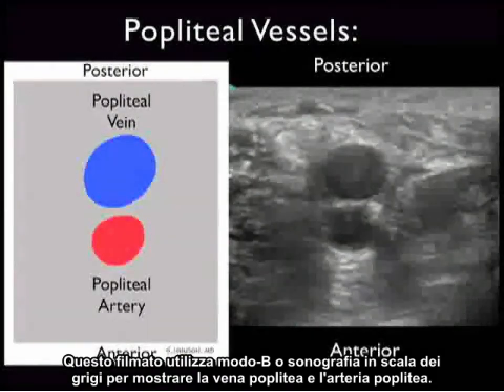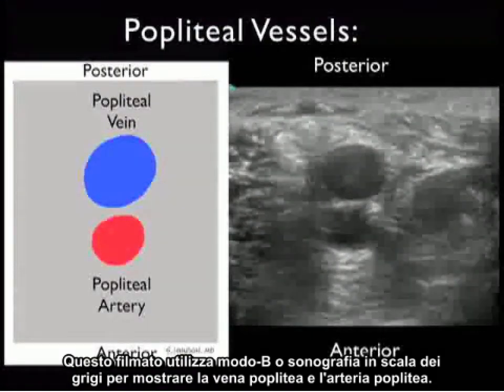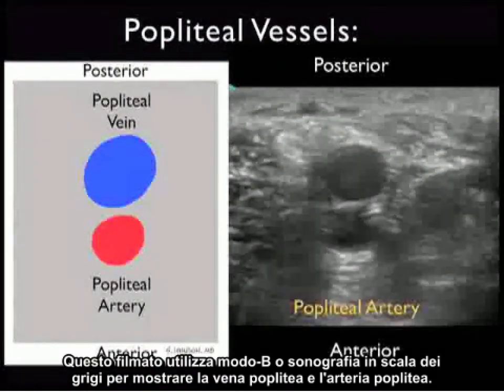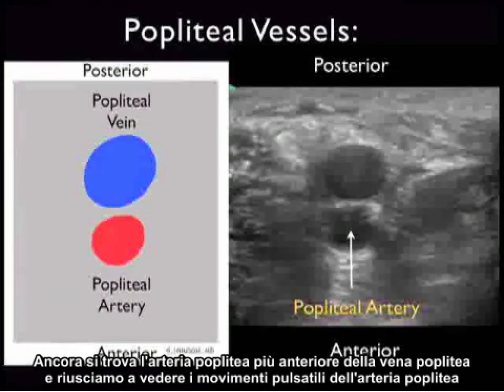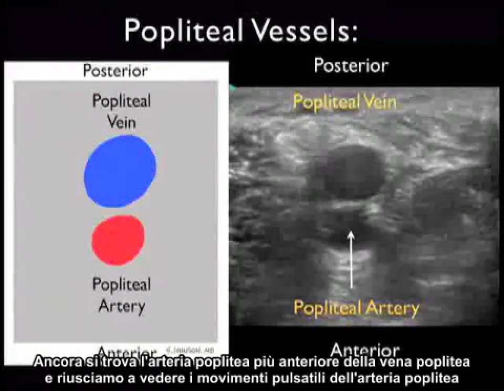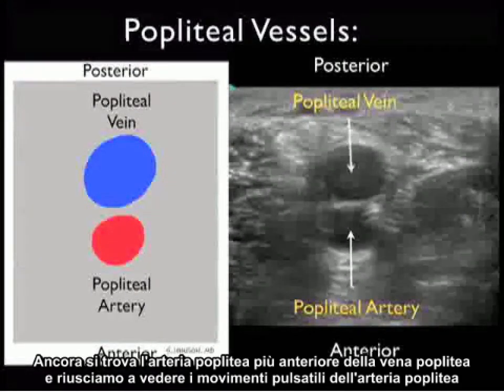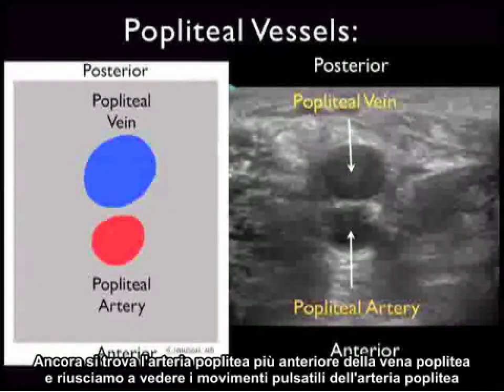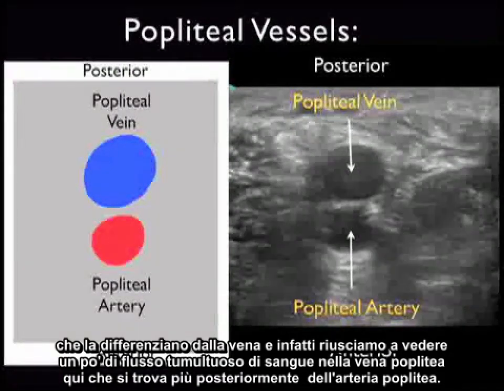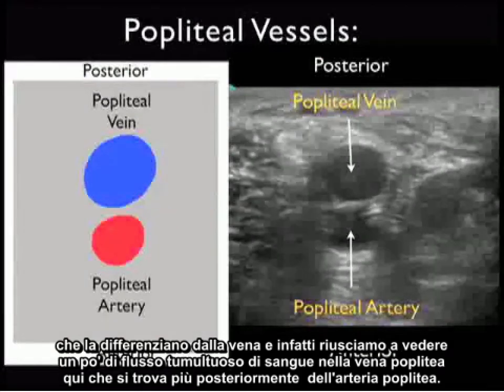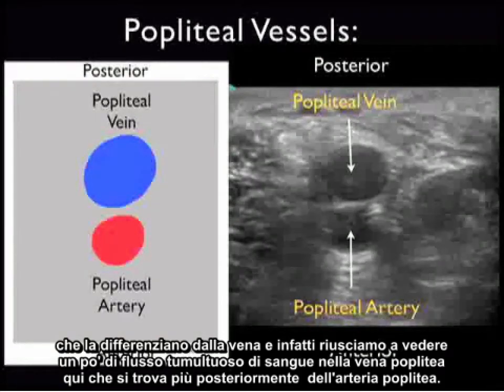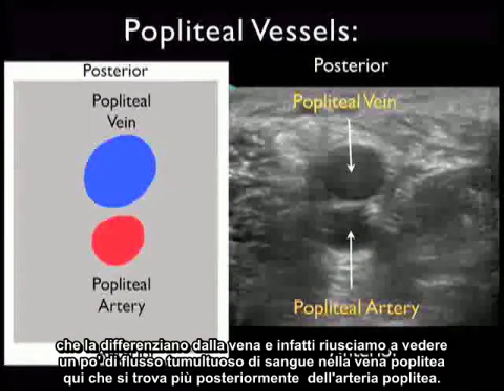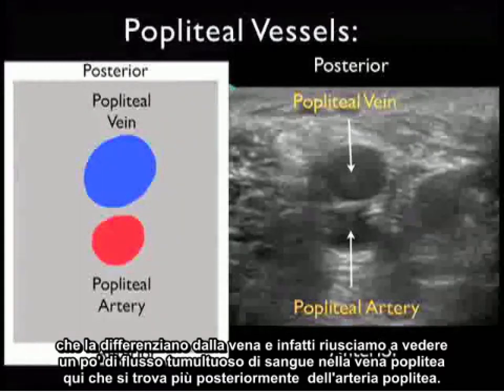This video clip employs B-mode or grayscale sonography to show the popliteal vein and popliteal artery. Again we can see the popliteal artery located more anterior than the popliteal vein, and we can see the pulsatile movements of the popliteal artery differentiating it from the vein. We can also see a little bit of turbulent flow of blood within the popliteal vein, located more posteriorly than the popliteal artery.